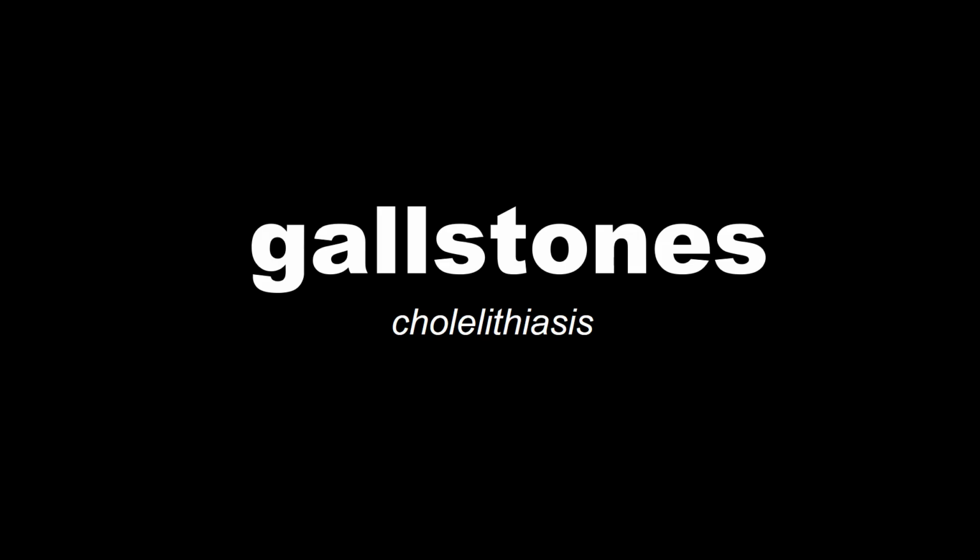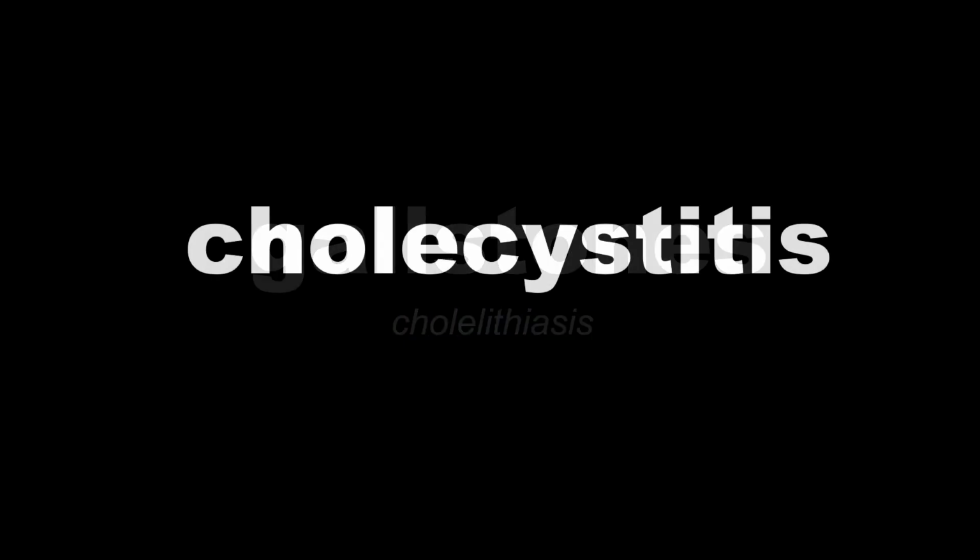So that's gallstones. There's one thing I want you to take away. It's to evaluate the entire gallbladder when looking for gallstones, especially the neck and the fundus of the gallbladder. If you do see a stone stuck in the neck of the gallbladder, roll the patient into the left lateral decubitus position to see that stone move, because impacted stones will often go on to become cholecystitis. So we'll change gears now and talk about cholecystitis.